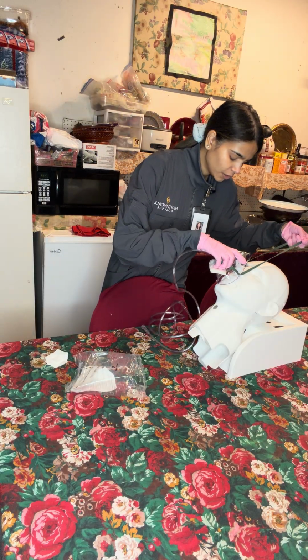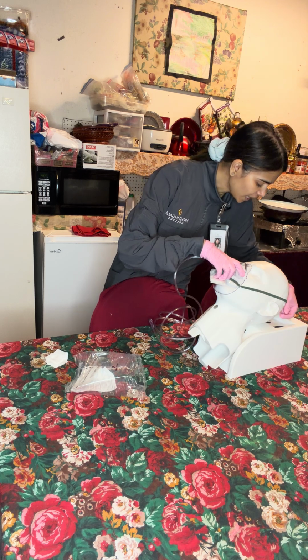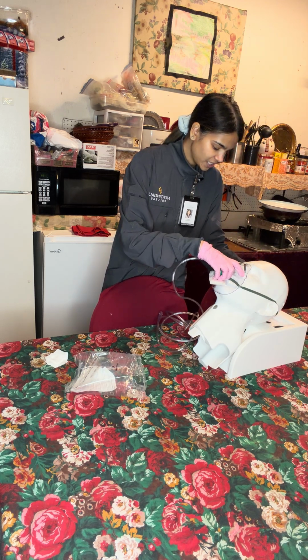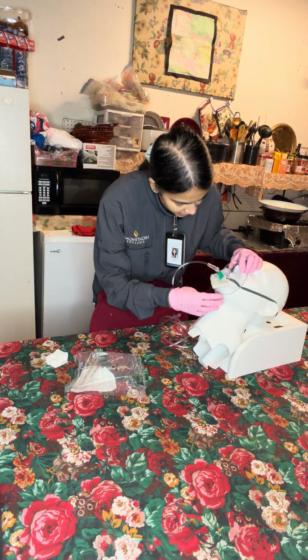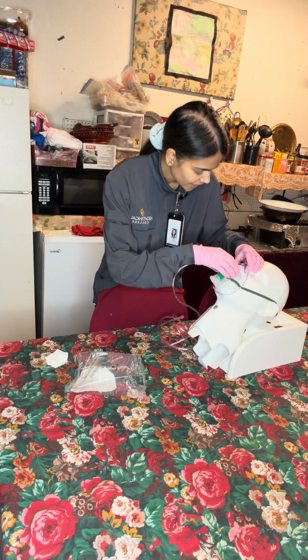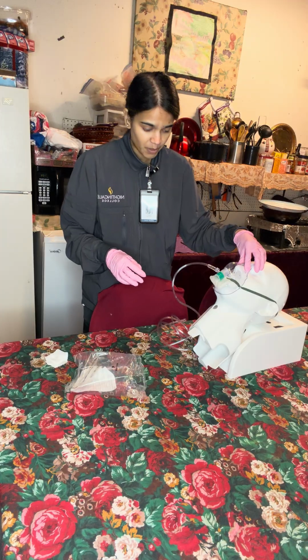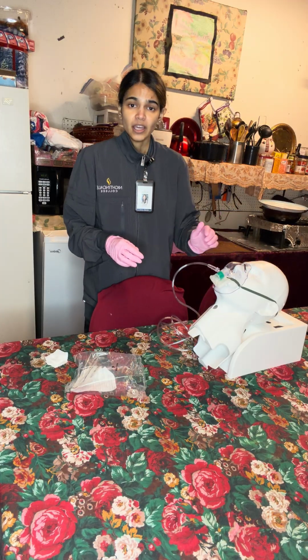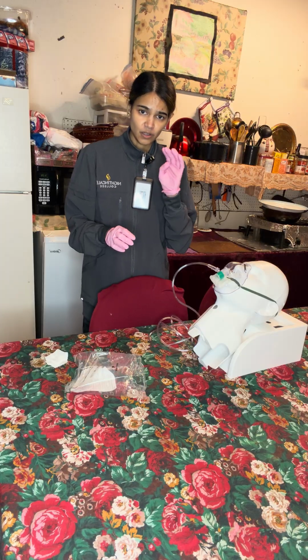The mask will go onto the nose and cover the mouth, and the band will go behind the patient's head and around the ears. We'll make sure that the mask is secure, and I will pinch the nose so that it has a better fit for the patient and ensure that a sufficient amount of oxygen enters through the nose and the mouth.